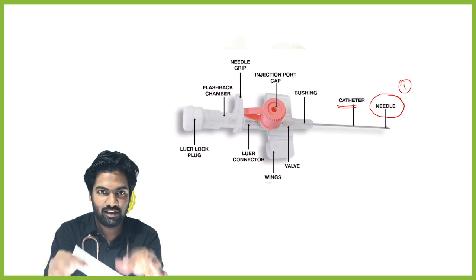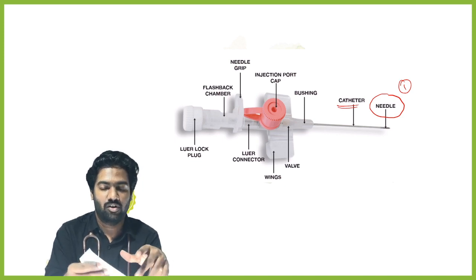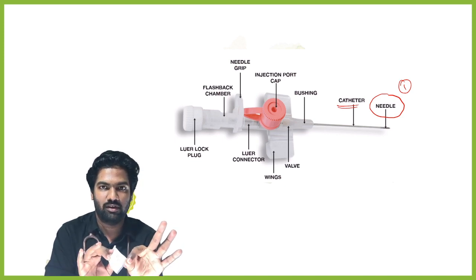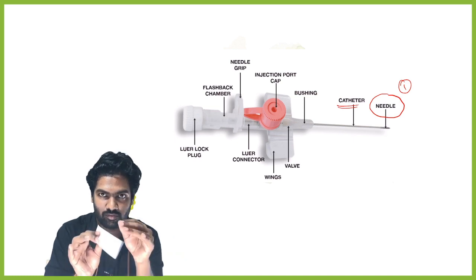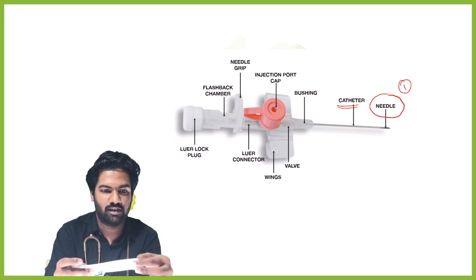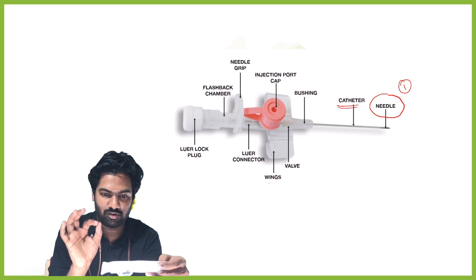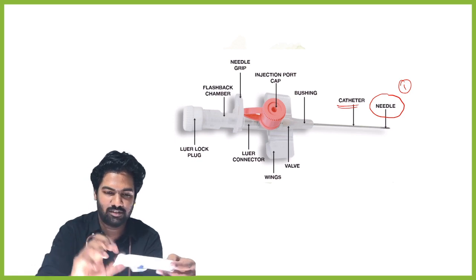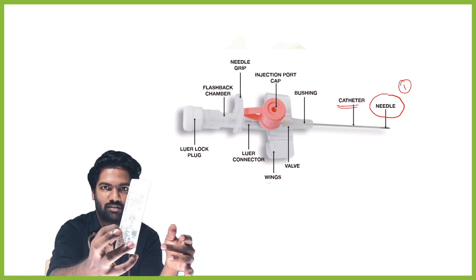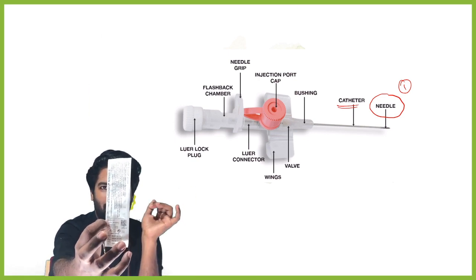Let's go deeper into this. As an undergraduate, my advice: the moment you see a new instrument like this in your hand, even before you remove any cover of it, see what has been written on it. See here they have written Vasofix, Luer lock; lots of information you can get here. 22 gauge, is it visible guys? 22 gauge is the size of the internal diameter which they are telling you.